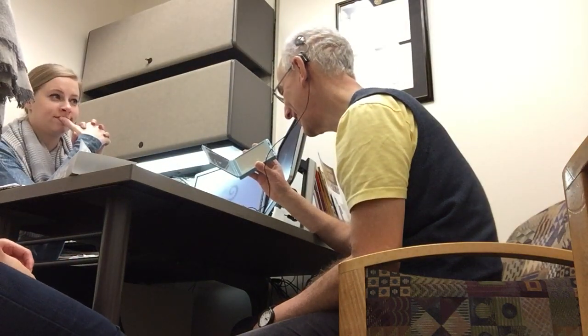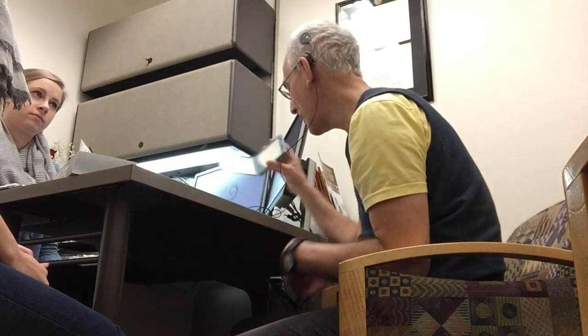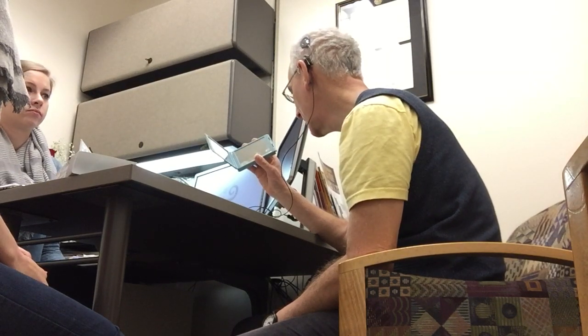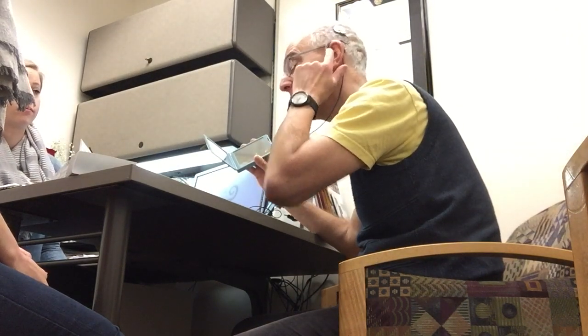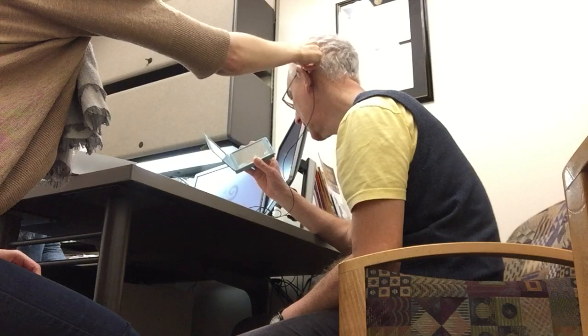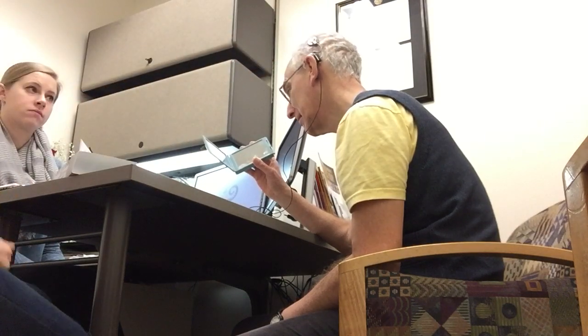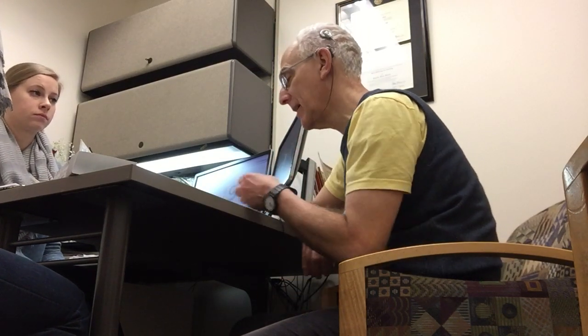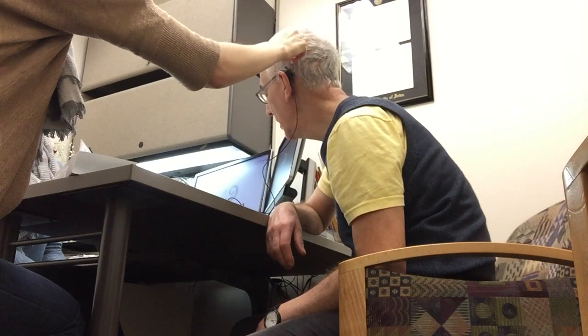Whoa, that's odd. So how does that feel on your ear? On the ear is fine. Lightweight. I thought this thing tucks in and wedges in, and so it hinges on the incision. This thing's just hanging there. Seems okay. It's way out in front like that. This microphone? It's not a microphone right there. That's the ear hook that you were pointing at. But yes, that's where it would go. Looks like that's how it's going to sit. And it feels okay. That's fine, I think. Perfect. Great. And your magnet feels good.